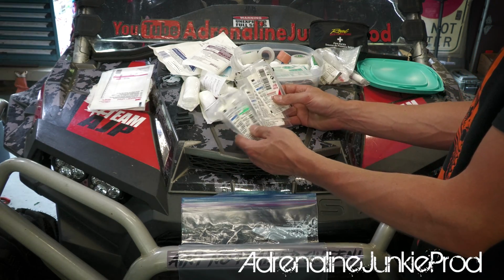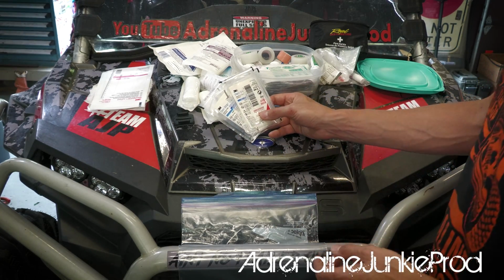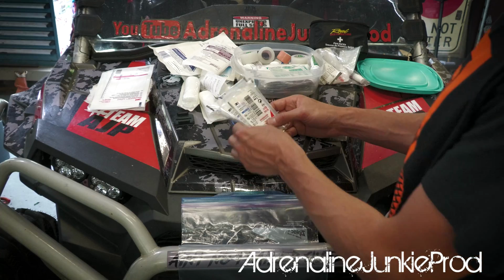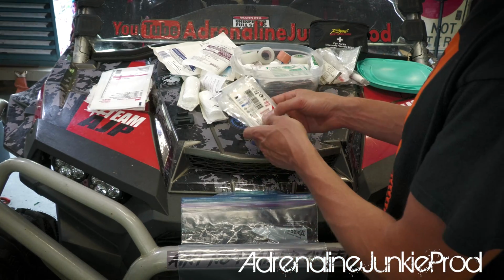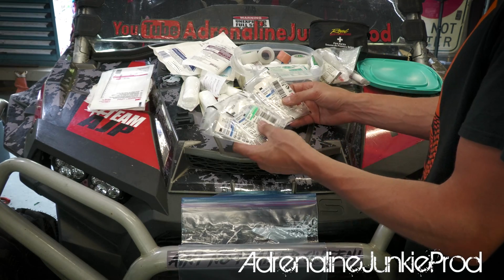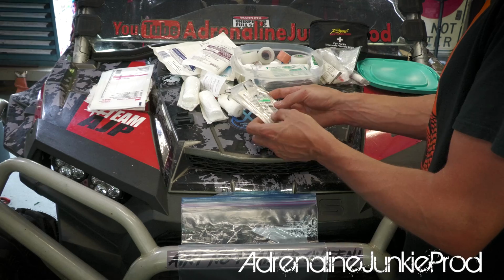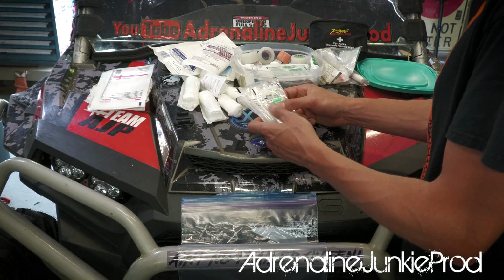You'll see these used in first aid a lot, and in the hospital sometimes when someone's got a cut, even on their head, and we feel we don't really need to put a stitch or two in there, we'll use some steri strips, and in 3 or 4 days they'll fall off and the cut will stay closed. These are amazing. You've got to get yourself some of these. You can pretty much pick them up at any pharmacy. They're not overly expensive. Get a pack or two of these, a pack of big ones, a pack of small ones, and you're good to go.